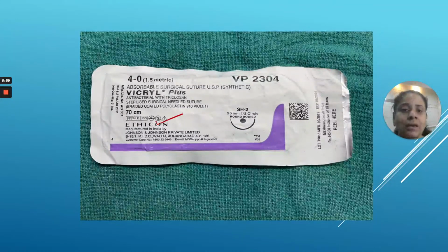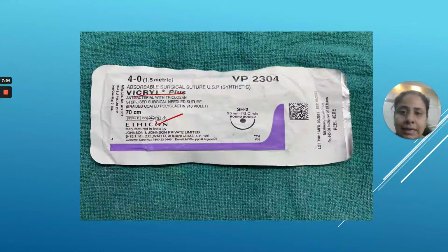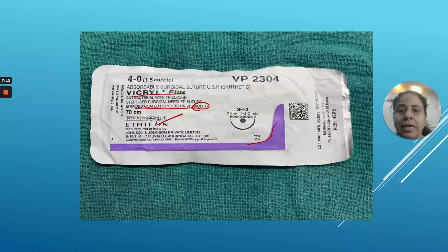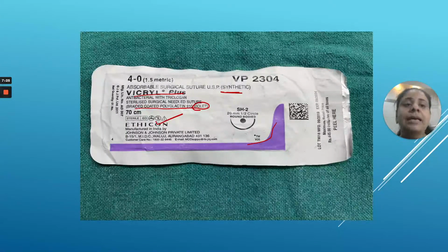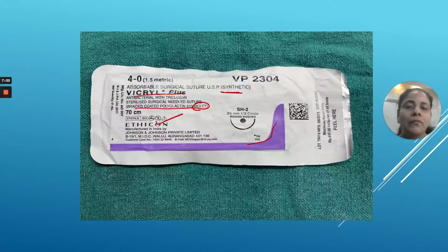I use this Vicryl Plus a lot. You can see it is still braided, coated polyglactin 910, and violet is the color of the suture, and here you can see the color of the suture is violet. This is again a synthetic suture. I am going to explain all these markings in detail after a few slides. Vicryl Plus is the most widely used suture material in the oral cavity. It's a costlier suture, so everybody cannot afford that in their practice. If you want to use any kind of resorbable suture, you can use simple Vicryl also.